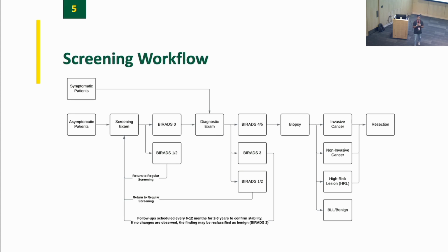There are many lesions which are better seen on ultrasound than they are on mammography. And that presents a challenge because you're labeling the mammogram with cancer, presumably because it was a screen detected cancer. So it's visible, but it may be more visible on another modality. And that's something that we'll touch on Friday.